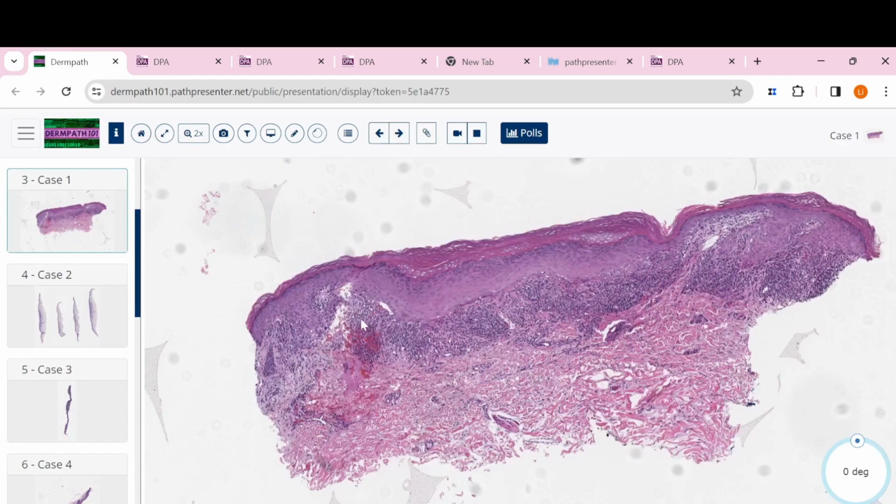And then because the lymphocytes try to attack the DEJ junction, sometimes you will see this empty space at the DEJ junction. Do not get confused about the split disorders, like pemphigoid or maybe pemphigus or other blister lesions, because normally the lymphocytes will attack the DEJ junction, so they will create this space.